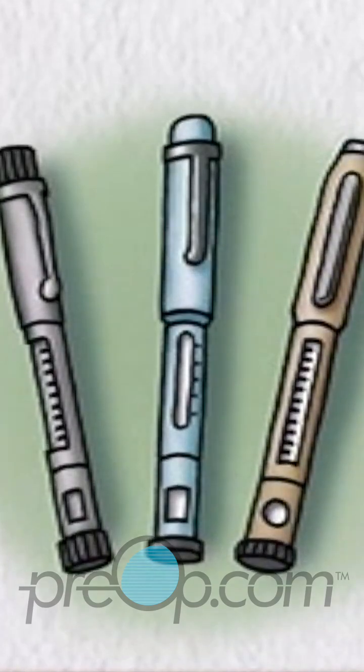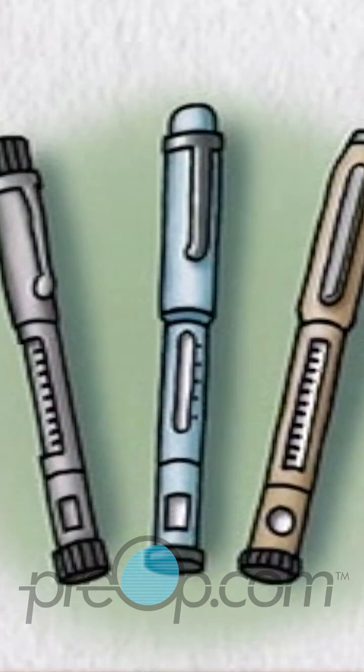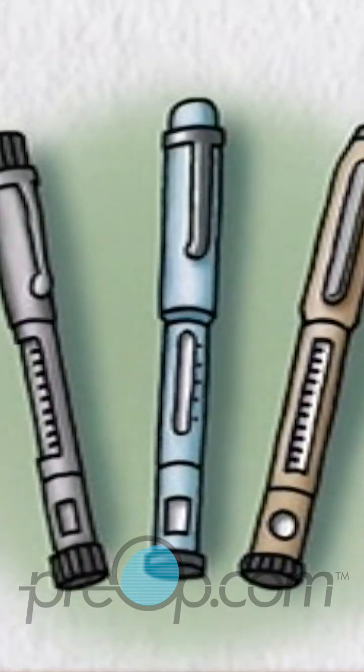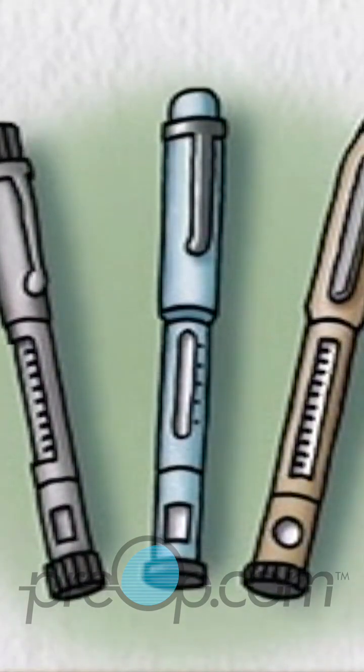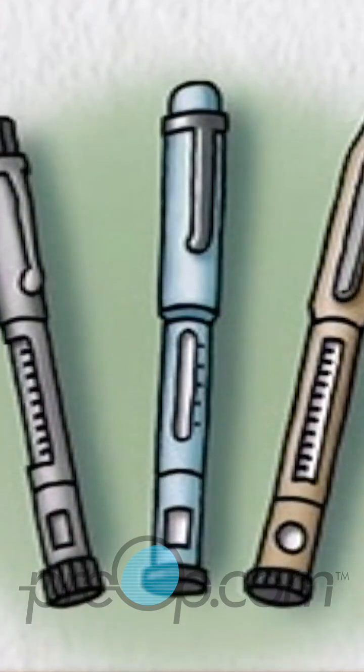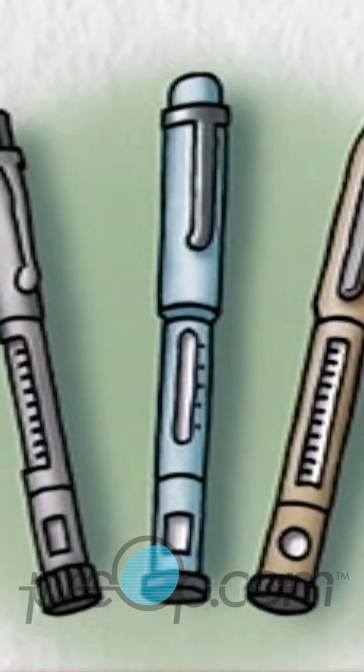Insulin pens are devices that can provide an easy way to carry and give insulin when away from home. Also for people who are not comfortable working with syringes and bottles to draw up and measure individual doses, the pens provide a convenient and accurate alternative.